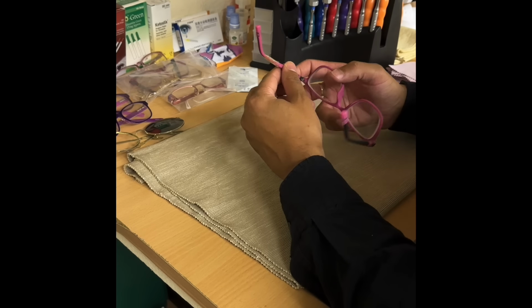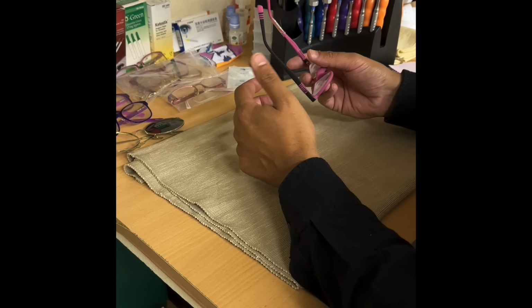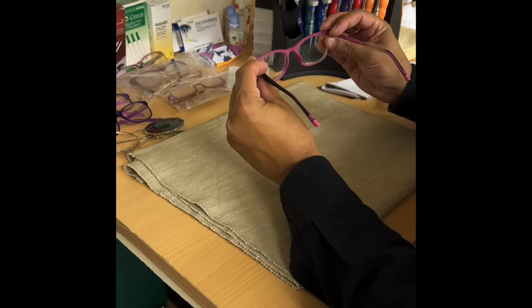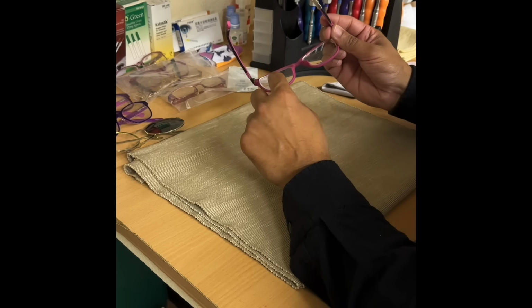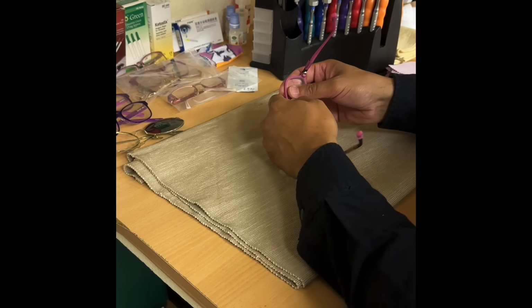So you have broken the side there. Temporary DIY job, that's absolutely fine. Marks on the lenses. So what we need to do is see if we can order a new frame and place these lenses into that frame. Let's see if we can remove the lenses.